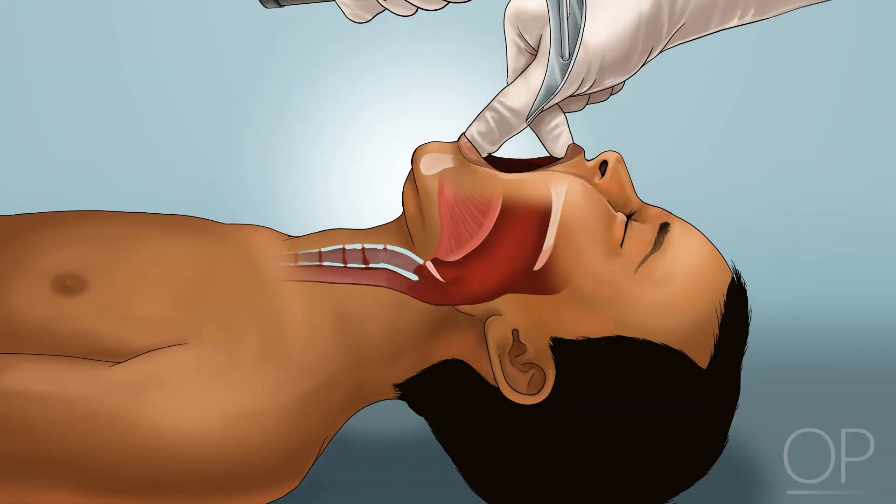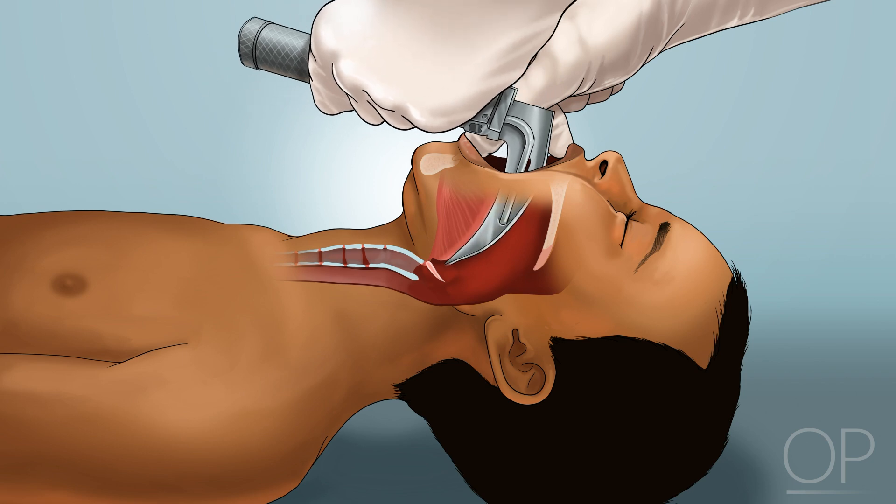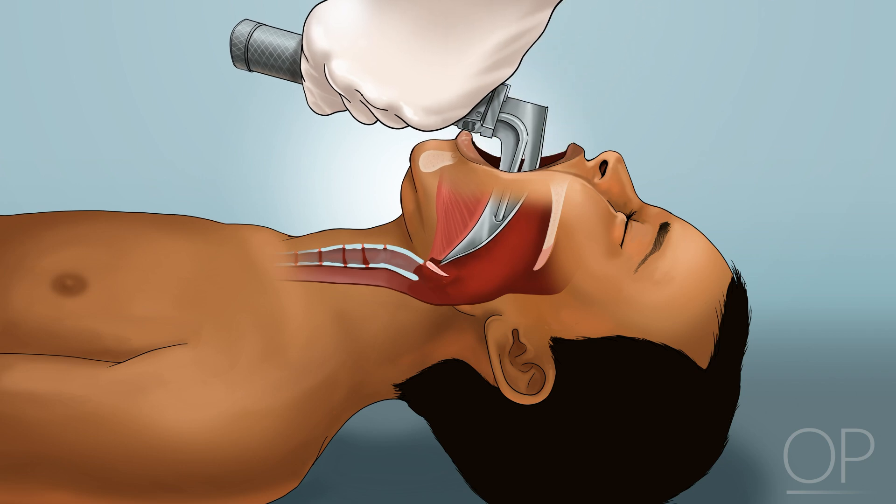The second technique is to advance the tip of the curved — for example, Macintosh — blade until it lies in the vallecula, just below the base of the tongue. The entire laryngoscope is then lifted in the direction of the handle to visualize the glottic opening.